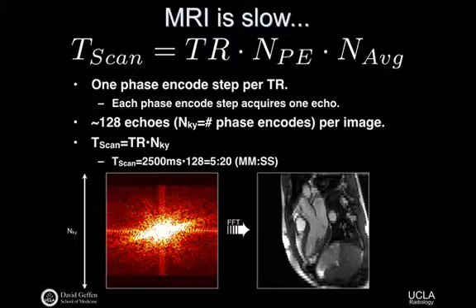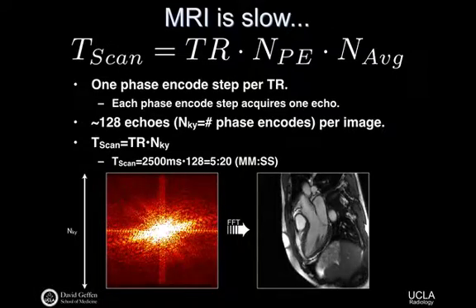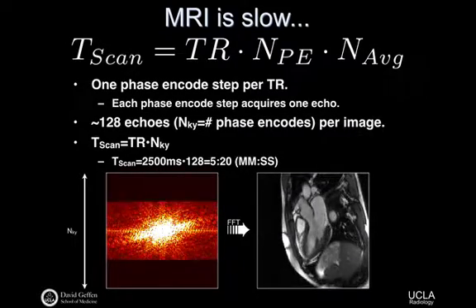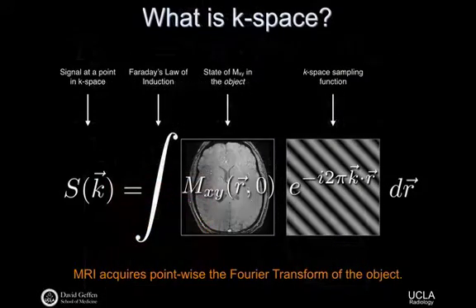And of course, there are so many tricks now in MR. That's actually some of the fun now, all the different, mutually compatible ways that people have discovered to really get the scan time down. And this movie that has been bothering you the whole time is just showing that when you have fewer lines of k-space, you have a blurrier and blurrier image. You couldn't possibly resolve it with the same detail unless you get more and more lines. Again, conceptually, we'll come back to this stuff a couple different times.